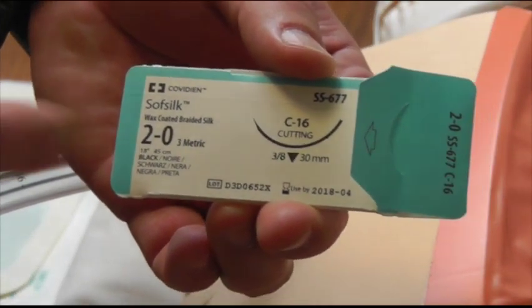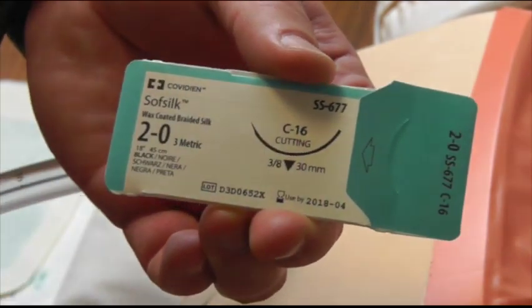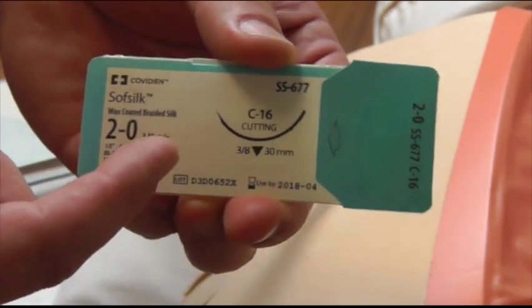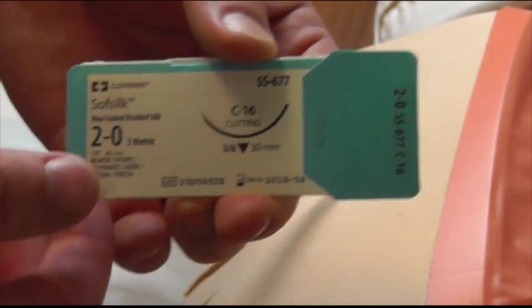I'm just using a 2-0 silk on a relatively large curved needle. For some reason, some places I've worked at have straight needles, I think it makes it hard with a straight needle, curved needles are better.